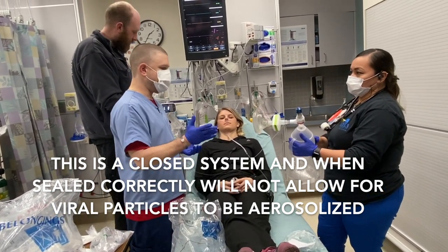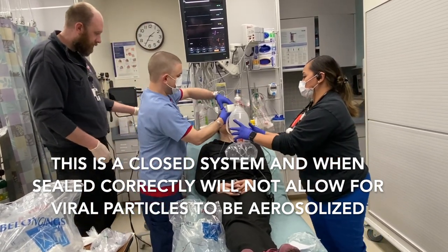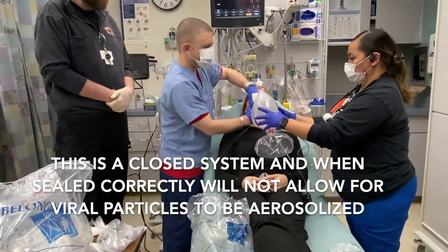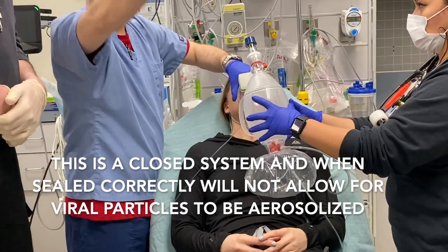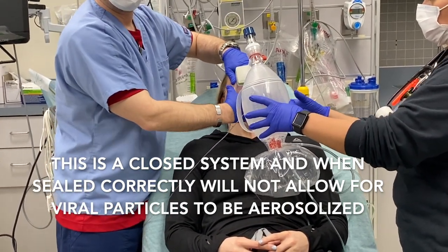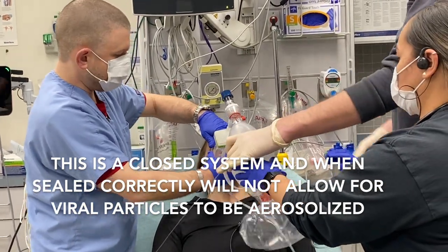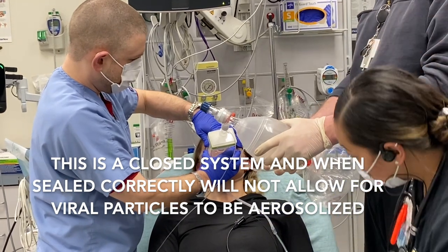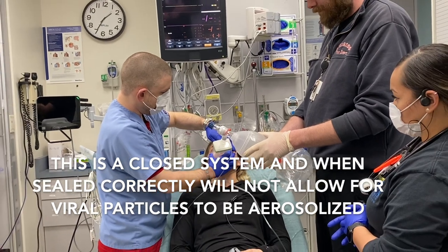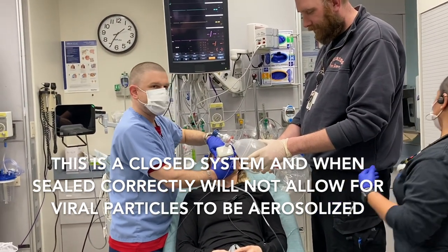Right. So now we're gonna go ahead, and this is the critical part. I'm going to have my respiratory therapist coming around here and holding the bag so that my nurse can be available for drawing up the medications for RSI. How are you breathing with this? Can you breathe okay? Don't bag. Okay, so breathe in and out for me. Okay, now holding a nice seal.